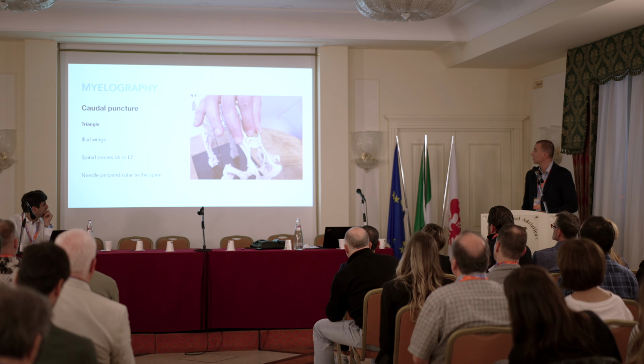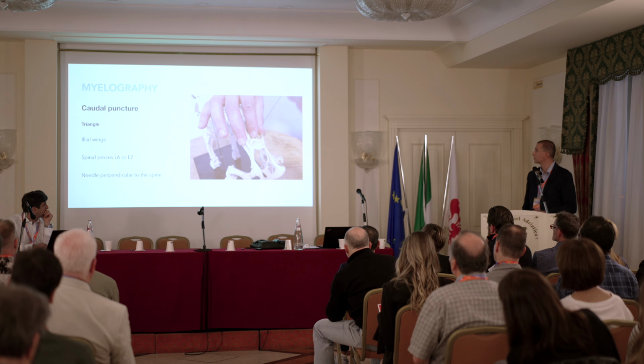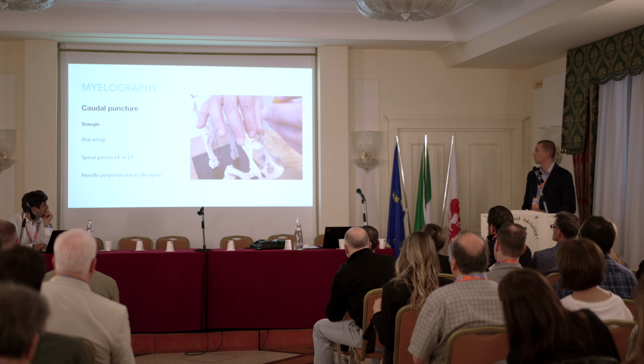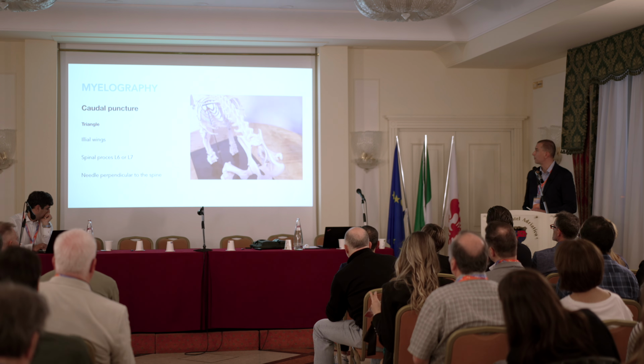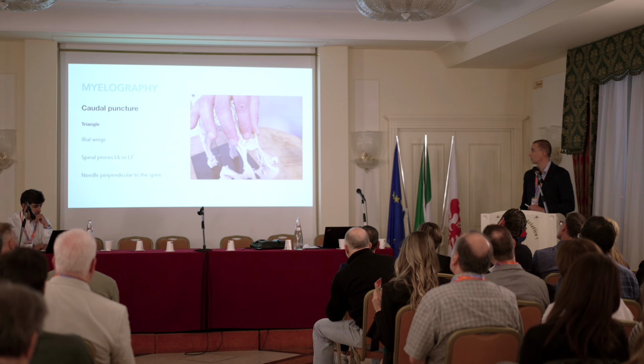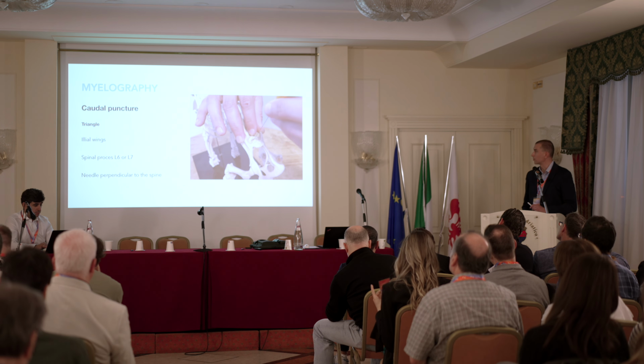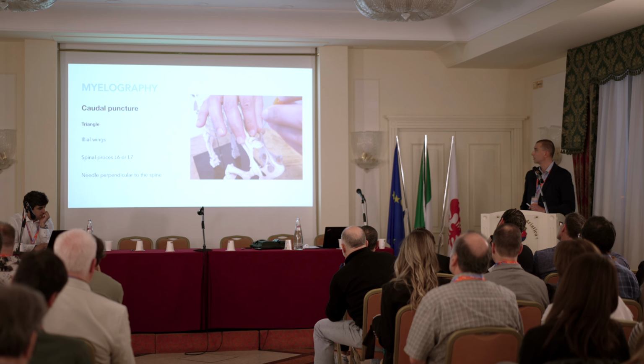So you can see how I'm holding the bones, and then the application of the needle is usually perpendicular to the spine. So it's not a very big problem to get in.